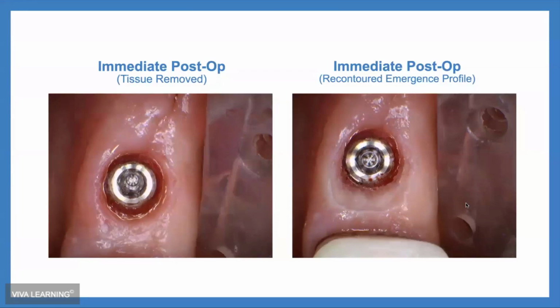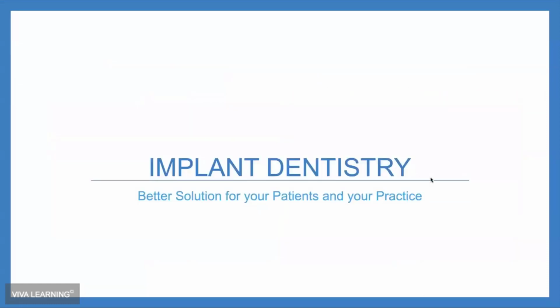You can even increase your emergence profile to help with the seating of the crown because it's probably going to blanch when you put it back in. This is an everyday headache at a lot of heavy implant offices where there's not really a good solution unless you have some kind of all tissue laser that can selectively remove the soft tissue without heating that metal down there.